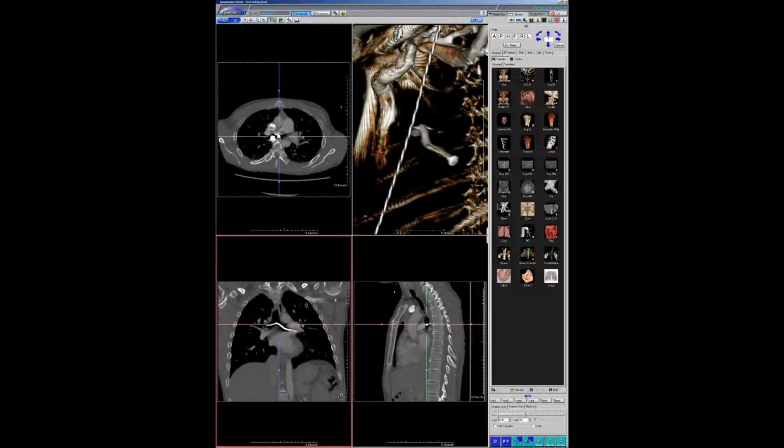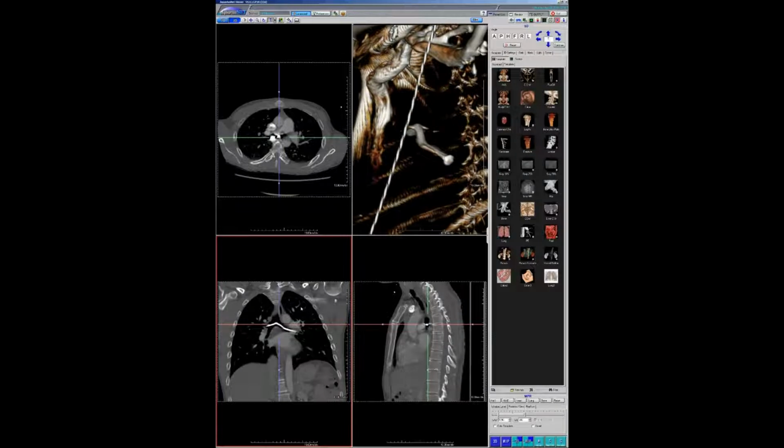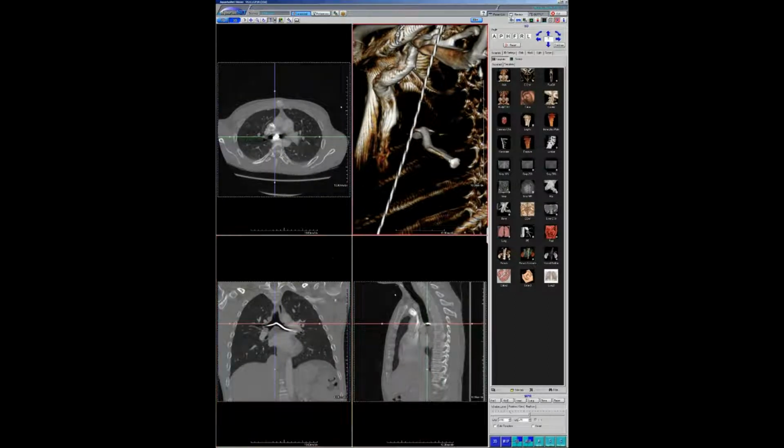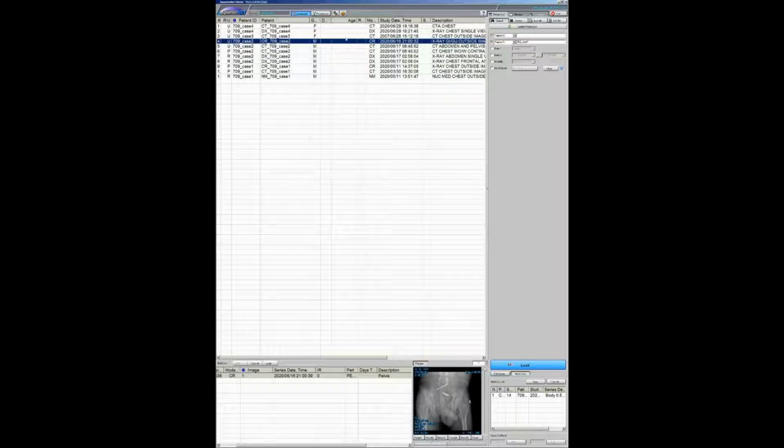And supposedly they tried to get it out with a bronchoscope, but it didn't quite work. It looks like it's wedged in there pretty good. Yeah, it's totally wedged in there, and they could not get this thing out. And then we have a CT showing he perforated his rectum, I don't even know what he did with it, but let's just leave it at that. This is a nice case, an older case.